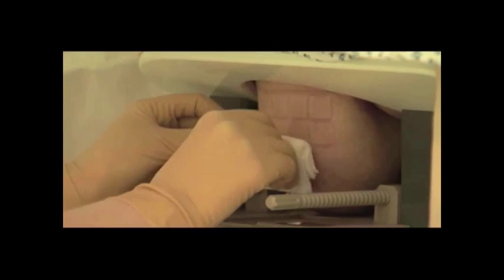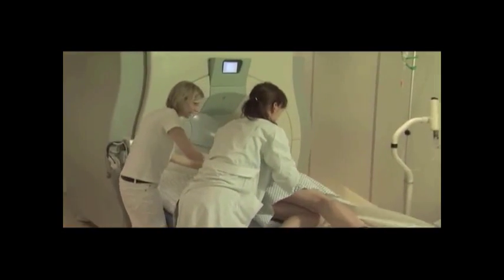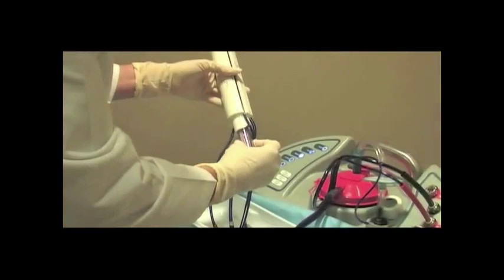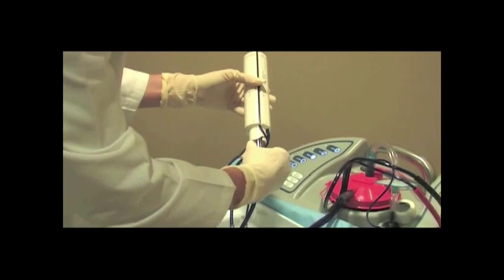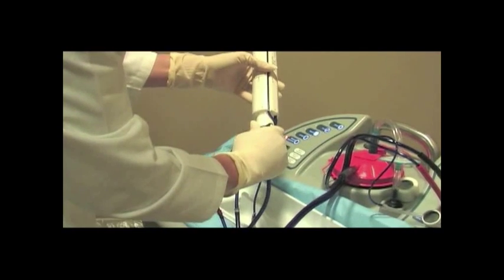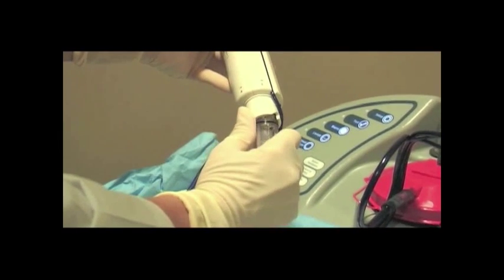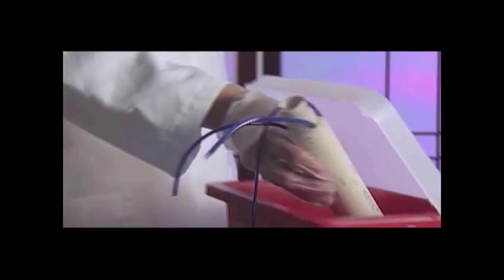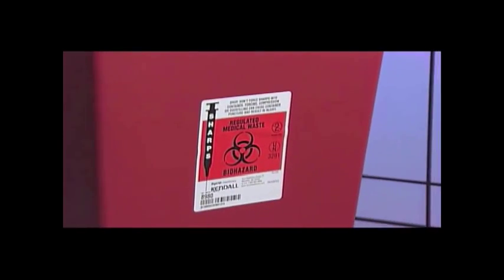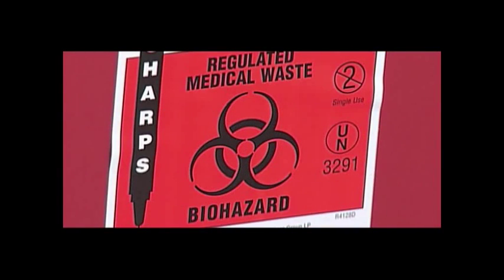Immediately apply pressure to the biopsy site and when ready assist the patient out of the coil. The cores can now be retrieved from the filter chamber at the back of the handpiece. Place one hand on the handpiece and the other on the filter chamber and rotate the filter chamber counterclockwise to disengage from the handpiece. Grasp the thin metal wire spatula in the tissue filter. Before pulling up on the wire, tilt the tissue filter basket toward the specimen collection dish. Appropriately dispose of all used ATEC product such as handpiece, marker deployment device, canister, etc.